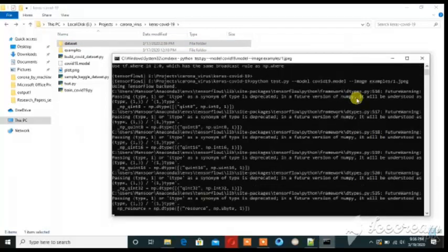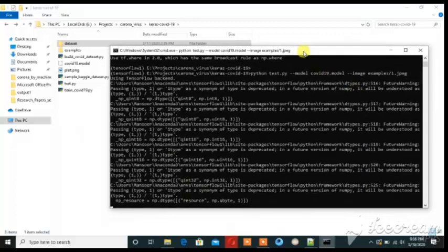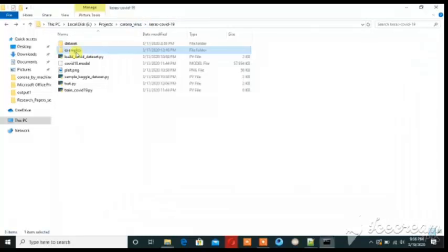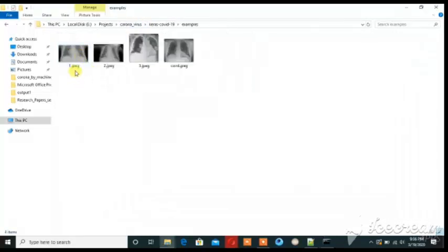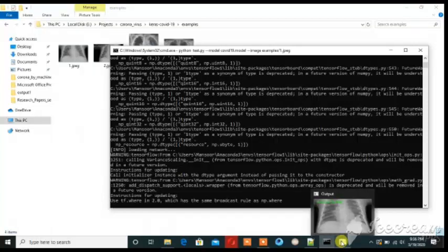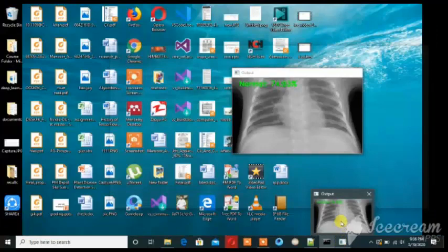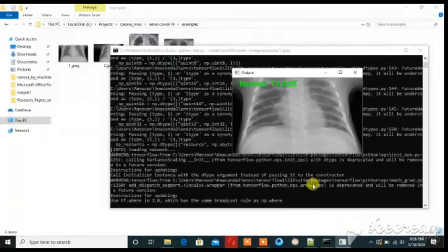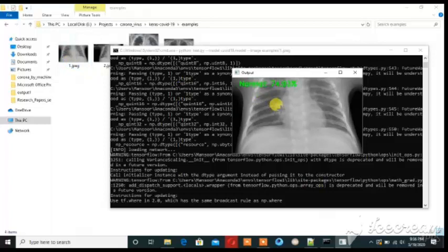I have some images for example. These are normal and these are affected persons. So we can see how we can detect this algorithm. First one is normal then we can detect this one.